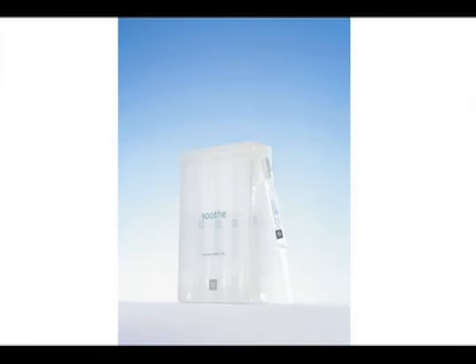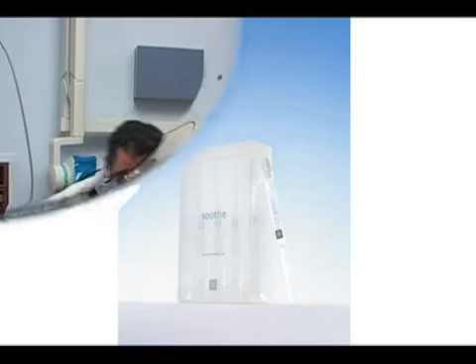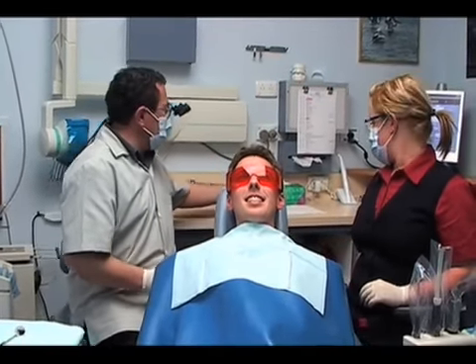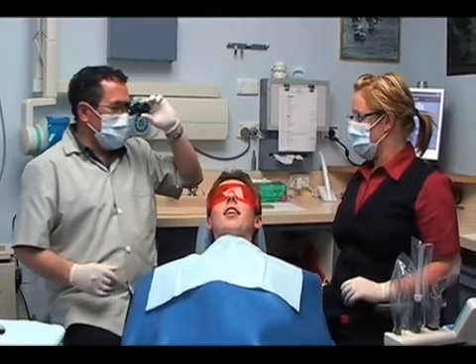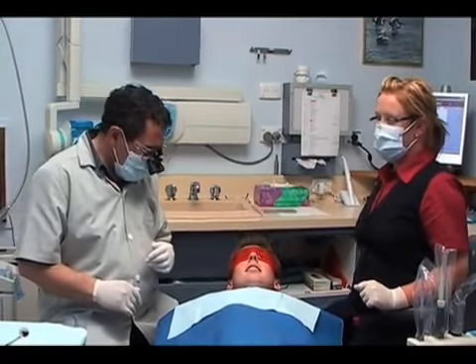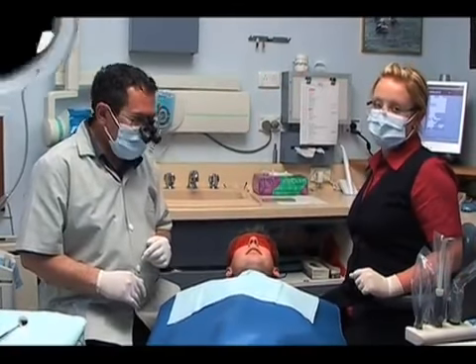If the patient has a history of sensitivity, you may want to prescribe a desensitizer such as SDI Soothe for half an hour prior to beginning the whitening procedure. Prior to starting the procedure, please ensure you, your staff and the patient are wearing appropriate protective eyewear, gloves and masks. Review and explain the whitening procedure and be certain it is understood by the patient.